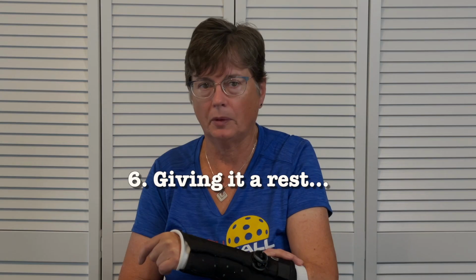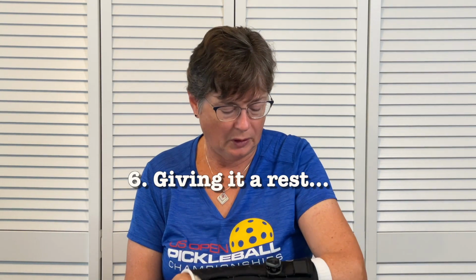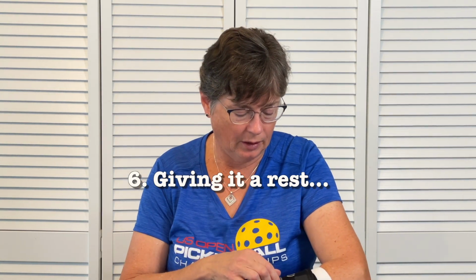But the other one is give it a rest. So what do I mean by that? I mean that I give it a rest by just letting it air out. Wash your hand, use a gentle exfoliator on it, such as a washcloth that has a little nap to it. But then what I like to do is, while watching TV at night, I just give myself a little extra quiet time in front of the TV.